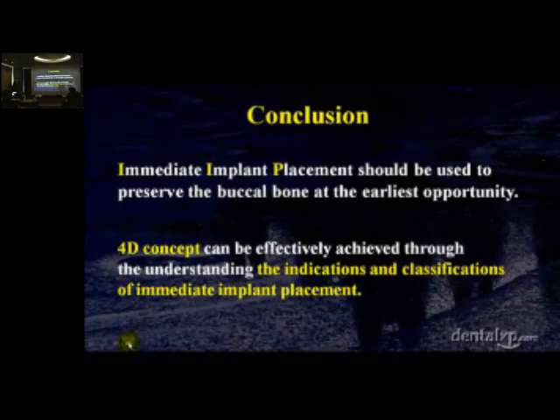Conclusion. Immediate implant placement should be used to preserve the buccal bone at the earliest opportunity. This concept can be effectively achieved through understanding the indications and classification of immediate implant placement.